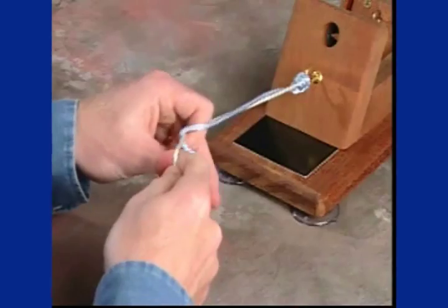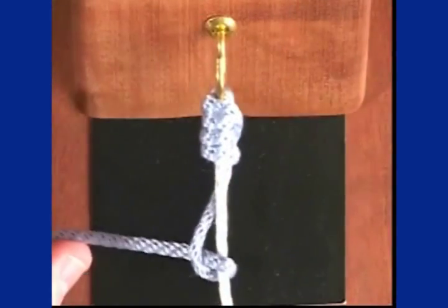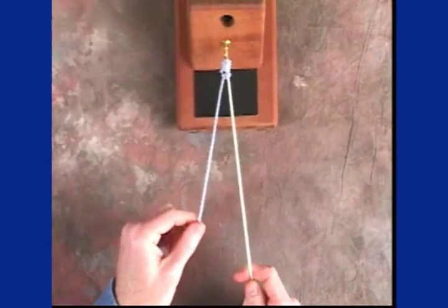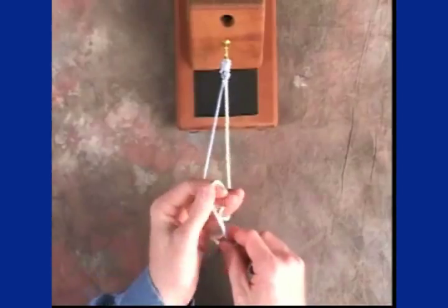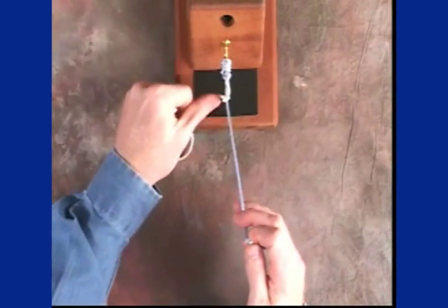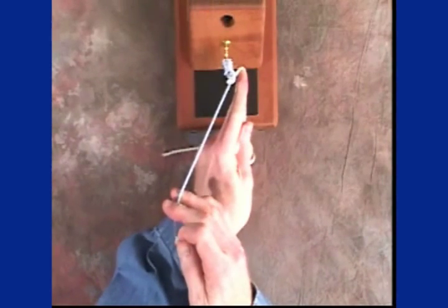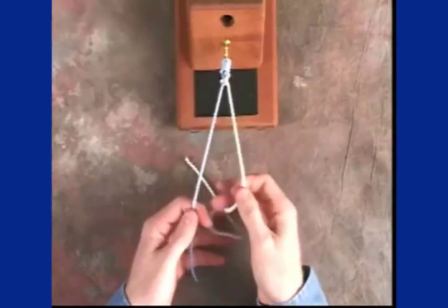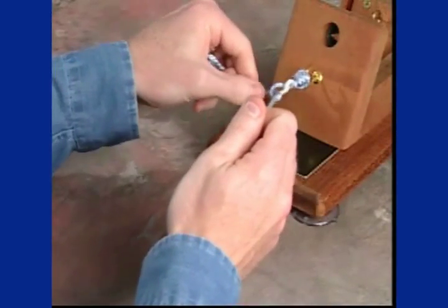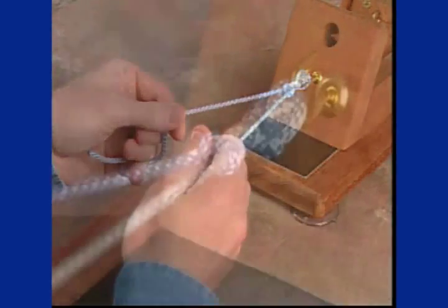Maintaining tension on your post, an initial overhand throw, or an underhand loop, is placed on the post limb and tightened down into the joint with back tensioning. The post and loop limb are then switched, and on the new post, an underhand throw, or overhand loop, is placed on the post and pushed down into the joint with back tensioning. This is followed by switching the post limb again and doing a final overhand throw on the new post limb, tensioning this with back tensioning.